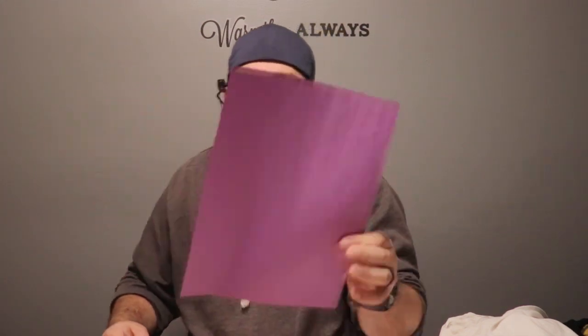It's a piece of construction paper, and I'm going to put it in front of me and try to determine. Point, hold it. Violet blue area. Violet blue area. So I'm assuming it's purple or purplish. So that was 2 out of 3. There you go, guys. So it's not a deal breaker, but it's not the greatest function on the ORCAM by far. But when you look at all the other things it does, it totally outweighs the con that the color recognition can give you. So that's how you do color recognition.